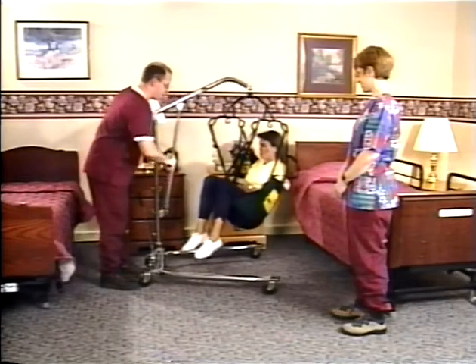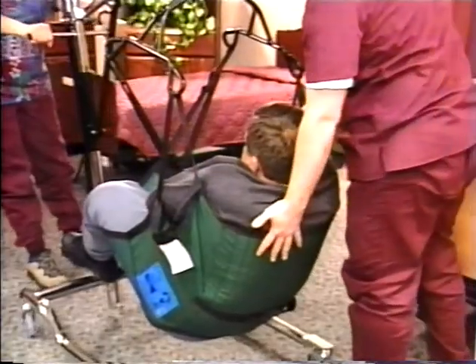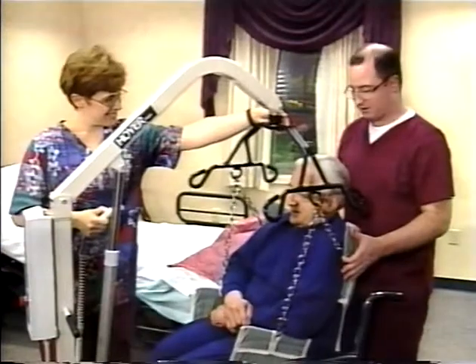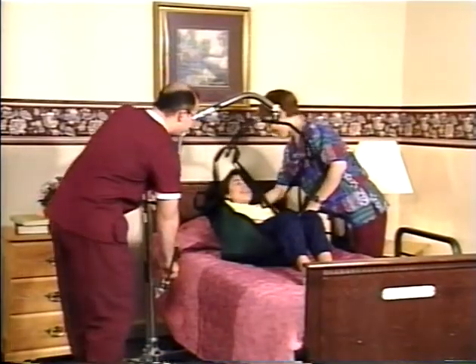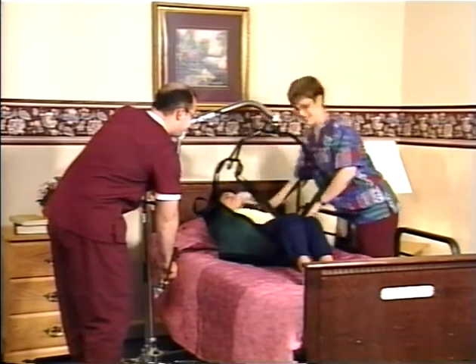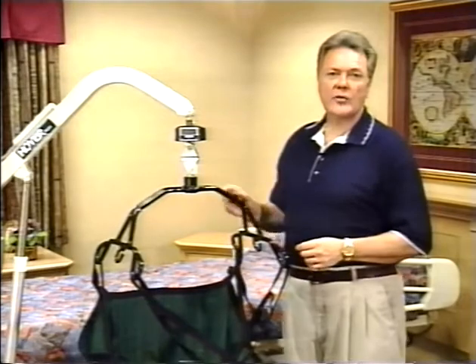Hoyer lifters help you lift and transfer people with a minimum of physical effort on your part. We recommend using Hoyer lifters whenever someone is too heavy or is unable to assist in their own care. Your Hoyer lifter can help prevent injury to you and your client. Before we begin with lift and transfer techniques, let's take a quick tour of the lifter.